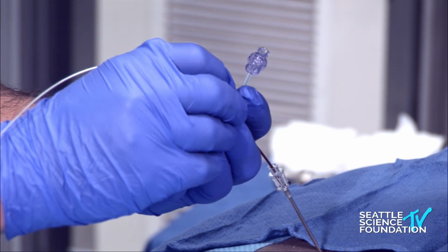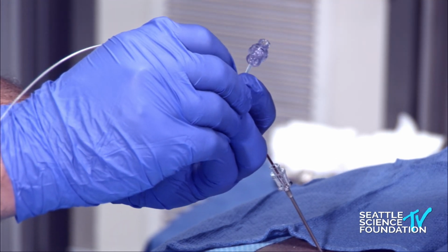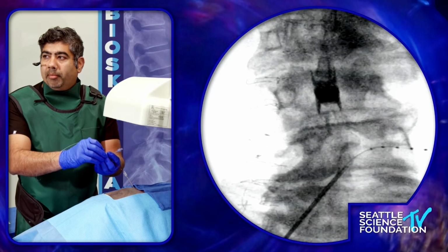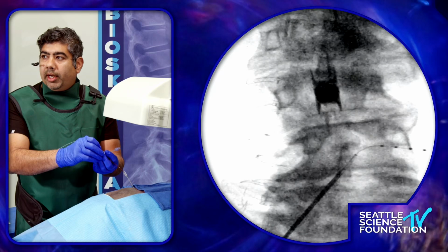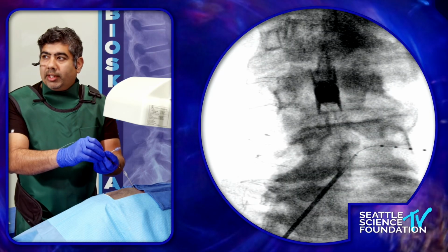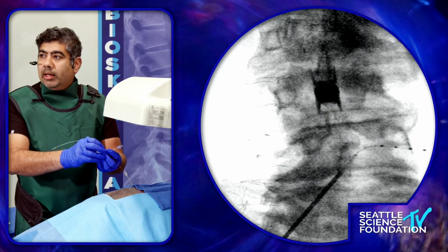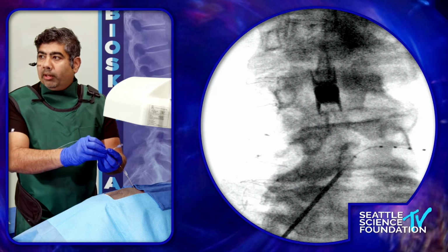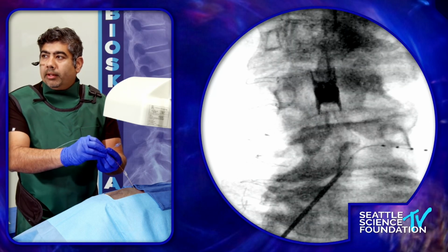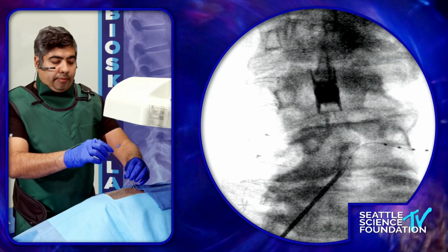So I'm going to hold, stabilize my lead, and I'm going to gently pull the sheath, and you can see the sheath coming back. And I'm going to keep a positive pressure there on the contacts so that the lead doesn't move too far out, nor does it get sucked in. And as soon as my sheath, which is that radio-opaque black ring you see, comes close to the spinous process, I know that this is the time I'm going to form stabilizing loops for my contact.